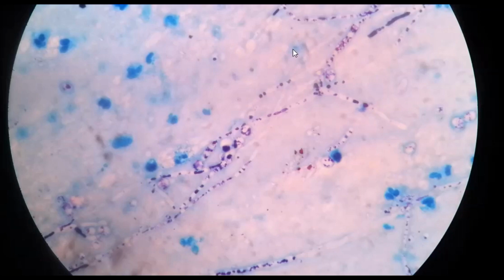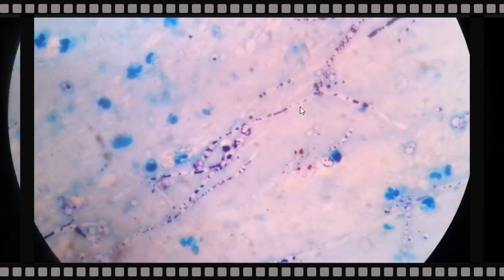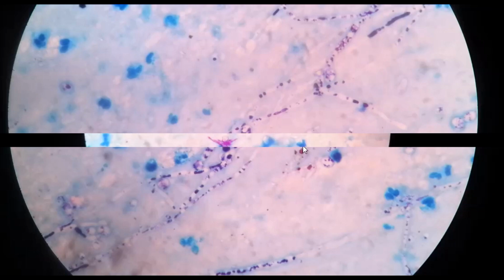On the basis of this report, the patient was treated with Co-trimoxazole and he benefited. After 3 months, his sputum was tested again, but this type of structures was lacking.